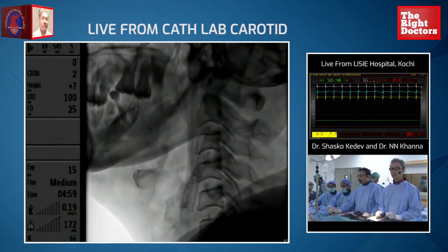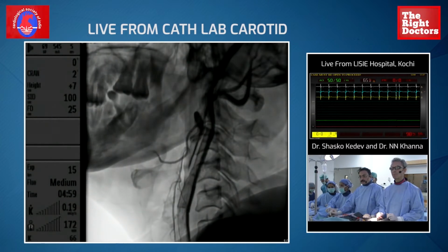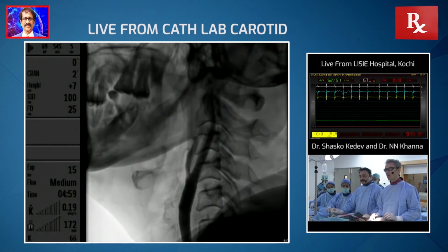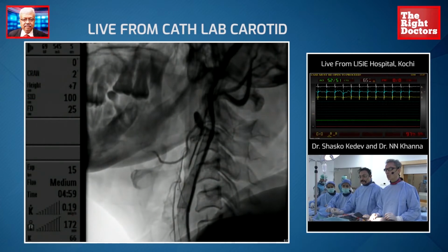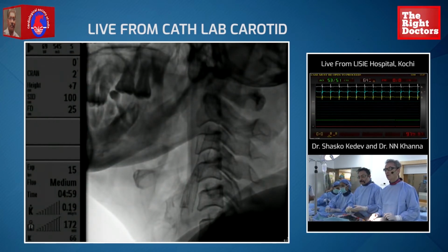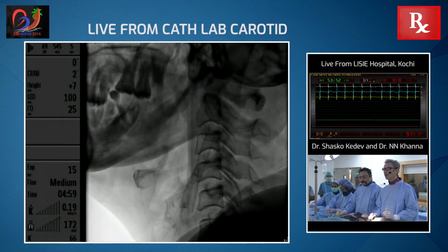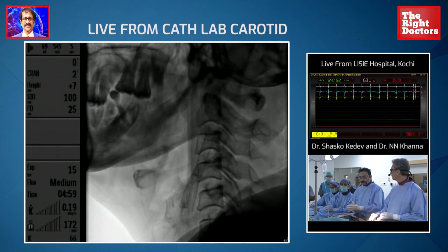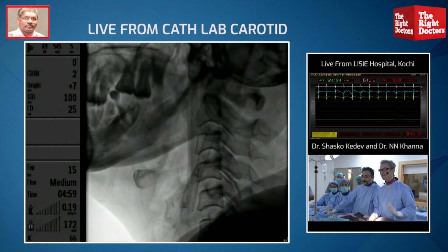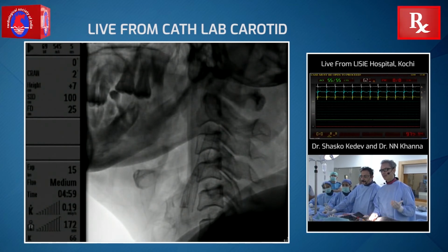Yeah, Sashko Kedev here. Looks like a perfect result, straight from the aircraft to the cath lab, I guess, for you. But this is after a long time you have not done a radial approach. Yes. So this patient was not originally scheduled for our transmission. With the original patient, we had some technical issues, so we postponed that case. And this patient was with symptomatic carotid disease with acute stroke, subacute actually. And in those situations, sometimes you might need penumbra thrombus aspiration. Also, it can be done radially, but we were somehow in a hurry because we put this patient on the table almost at 1:30. Yes, at 1:30. So that's why we went femoral. We are a little bit disappointed, but what counts at the end is the patient outcome. So it's very important access site, but at the end is very important final outcome.